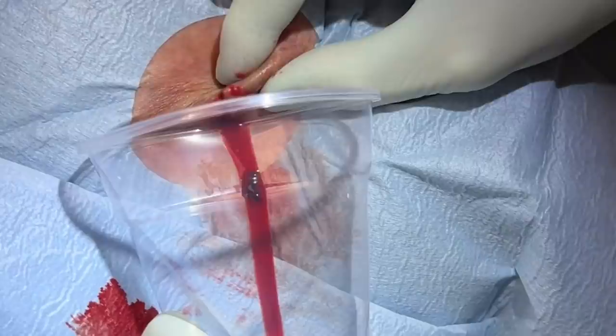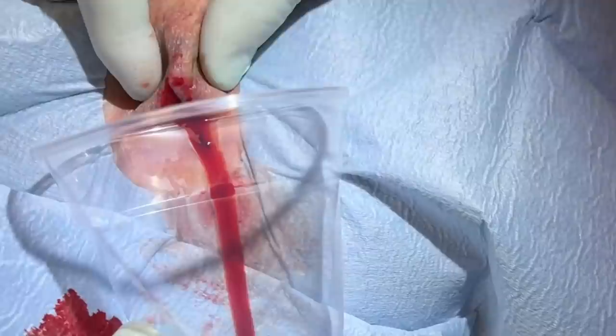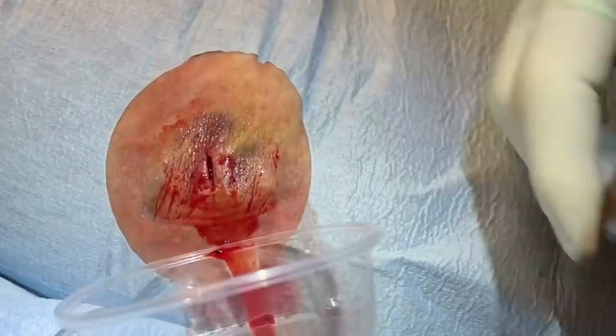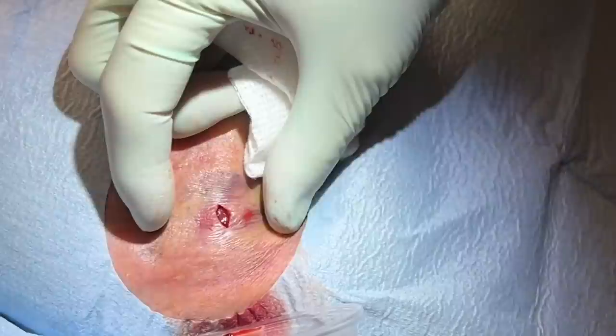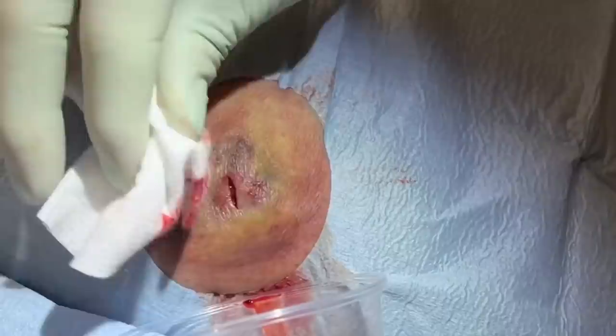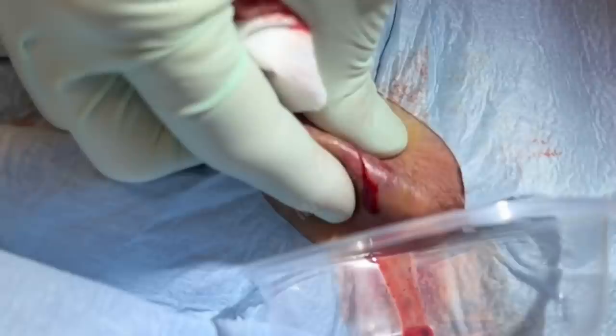It's just that little pocket. You can see the bruising — you can see how that's gone down quite a bit. We're going to flush a little bit in there. I don't feel a lot of cysts in there either. When we get to the bottom, that can start to get pretty tender. You can just kind of see it's just kind of mushy at the bottom there. I don't see any cyst material — just kind of fatty breast tissue underneath, which is common. We're feeling in the pocket for any remnants of a cyst.